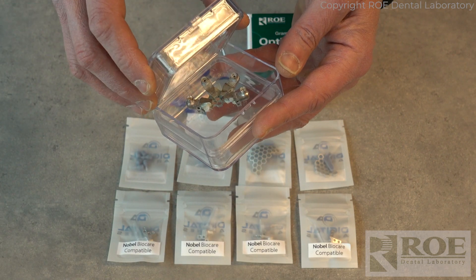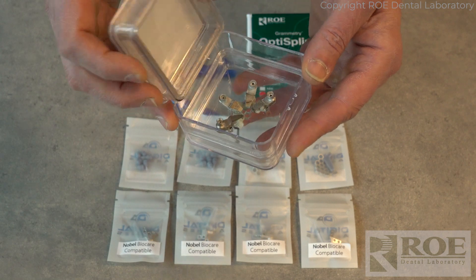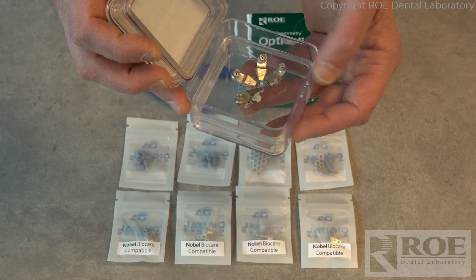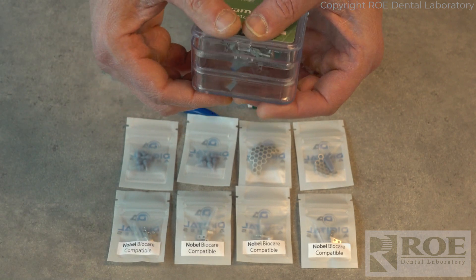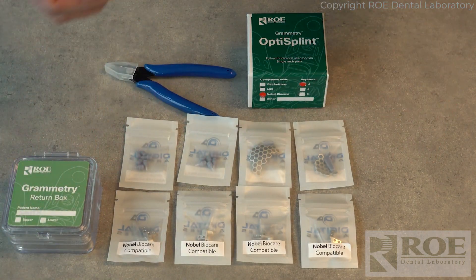Just be sure when you close it down that you're not closing the side of the top onto the OptiSplint. You want it centered, and then carefully close it down — nice and sealed. And that is a Grammetry kit.